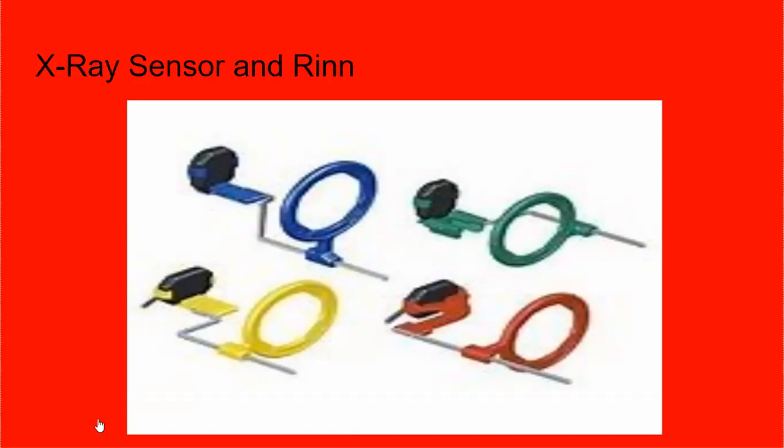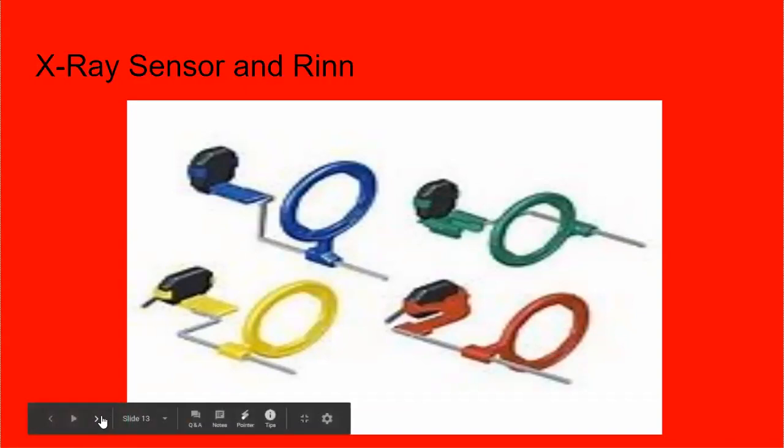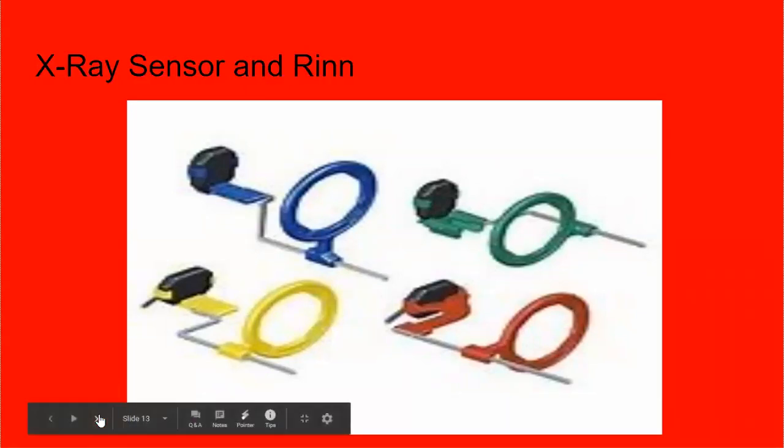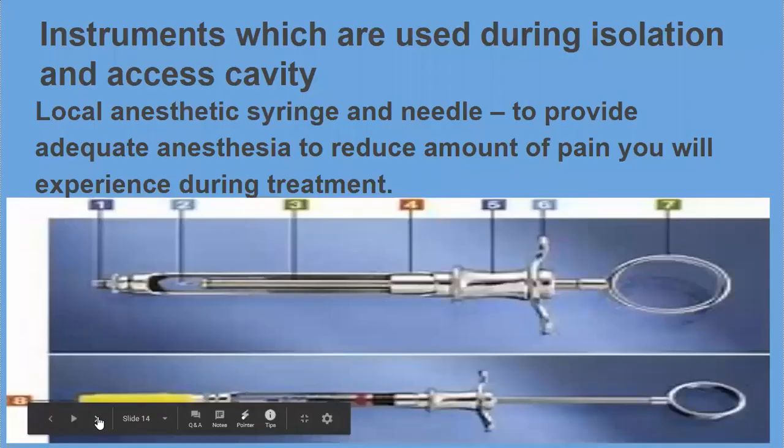Second, it gives the doctor a visualization, and they can also use the computer to measure on the x-ray how deep they need to go, and it's a bunch of different things. And then at the end of the procedure, you need to take a final x-ray so that the doctor knows he got all the way to the apex of the tooth, and to also send to the insurance company to prove that the work was completed.